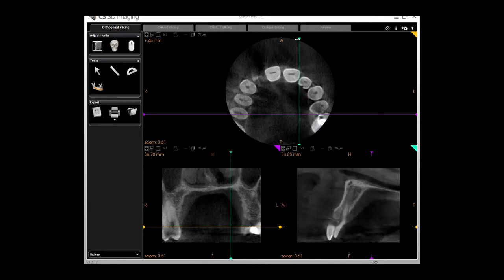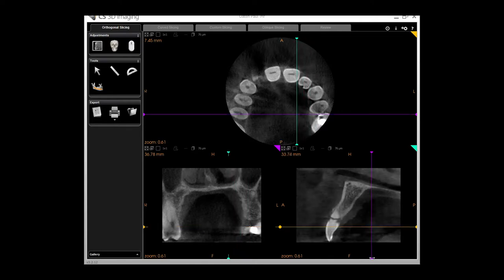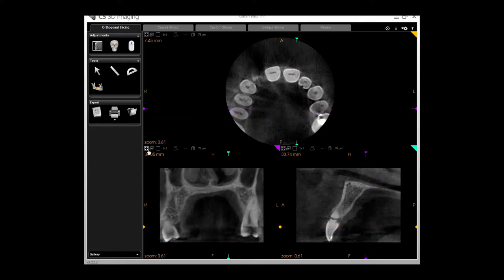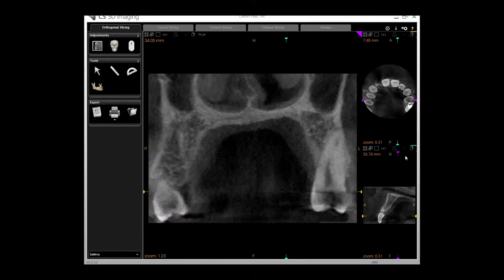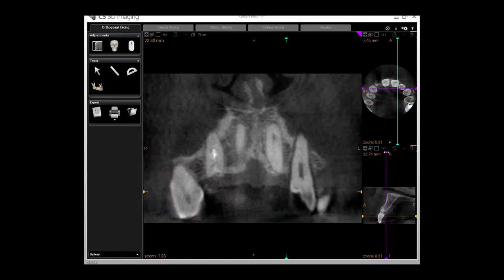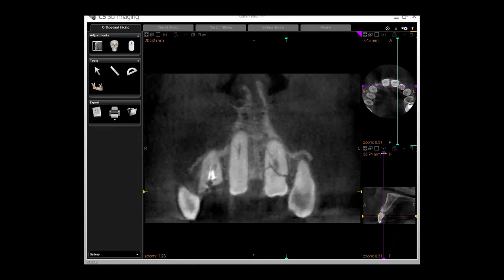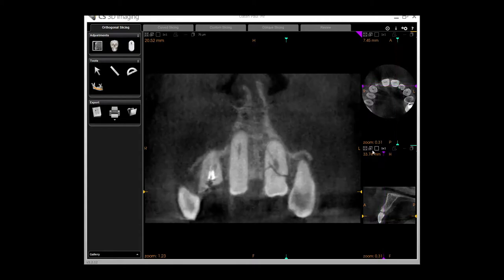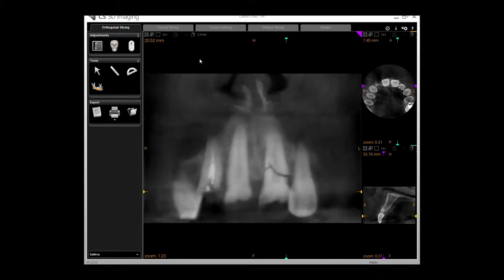In the orthogonal tab, if I drag the top of any of the coloured tabs it will move the scan appropriately depending on which section I'm in. The lower right area will move us through the MPR scan, and I can extend the views to have a larger screen and two smaller screens on the right. As I go anteriorly in the MPR it becomes more difficult to view, although the fracture lines in this scan are very clear. I can move back and forwards through the orthogonal part of the scan, giving me different coronal views, and I can increase and decrease the thickness of the scan in CareStream.